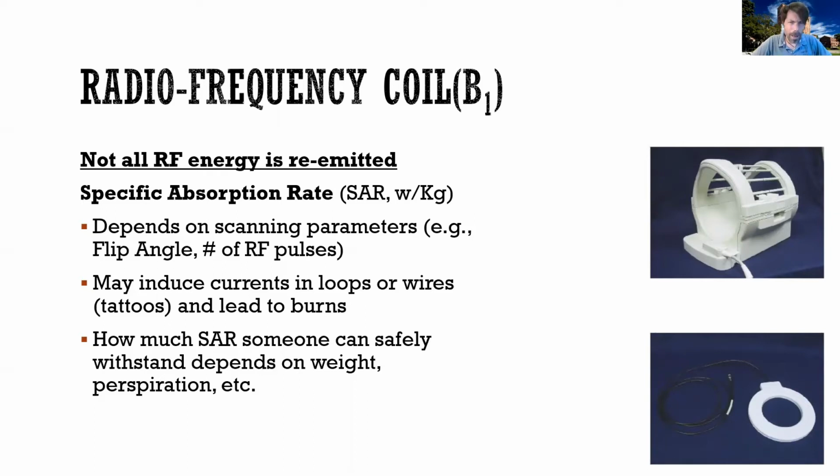Most tattoos are typically fine, but shiny tattoos, colorful tattoos, are often made shiny and colorful by using microfragments of metallic type material, which means that there is a risk, if somebody has a big tattoo and the person absorbs a lot of energy, that it could heat up and burn the participant. So this is a risk that, as you'll imagine, could happen often. So we always ask our participants if they have tattoos. We ask where the tattoo is.